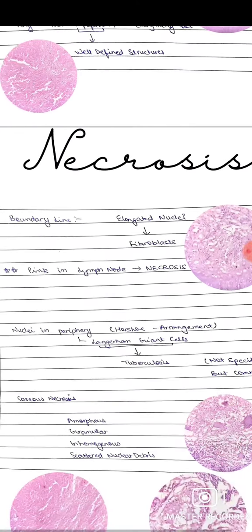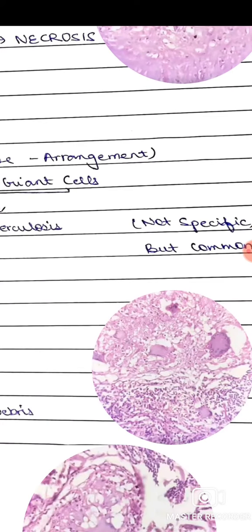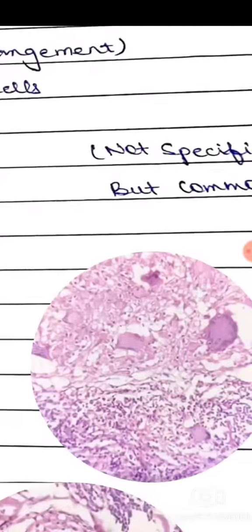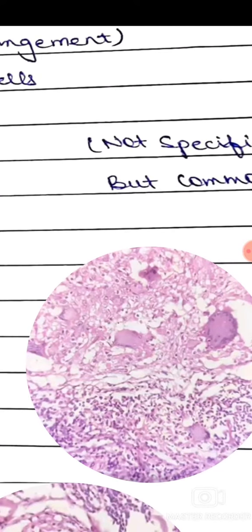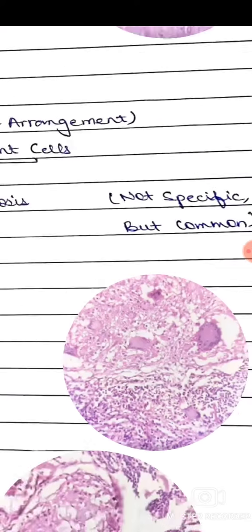After that, we see various large cells with nuclei in the periphery. These cells are called Langhans giant cells, and they are a characteristic feature of tuberculosis — not specific, but common.